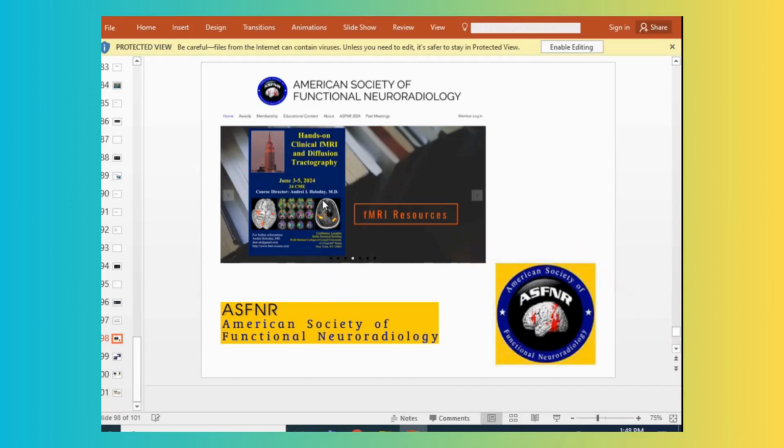Some centers are also routinely doing ASL perfusion in the routine brain protocol, because ASL doesn't require gadolinium. They are using ASL for diagnosis of stroke, tumors, or white matter diseases. So it's like another sequence. And fMRI data, because these are EPI images, doesn't take that long. They're very fast. 2 or 4 extra minutes is not much time.